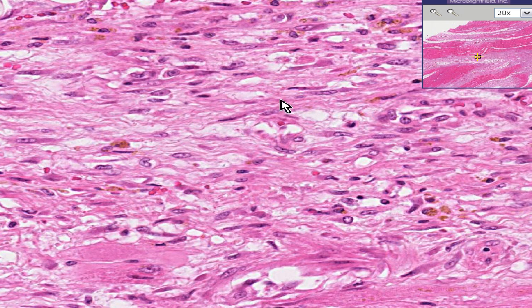There are probably some fibroblasts as well. But the granulation tissue, or the so-called organizing stage of myocardial infarction, is relatively void in neutrophils, and it is also relatively void in dense fibrous connective tissue as well.